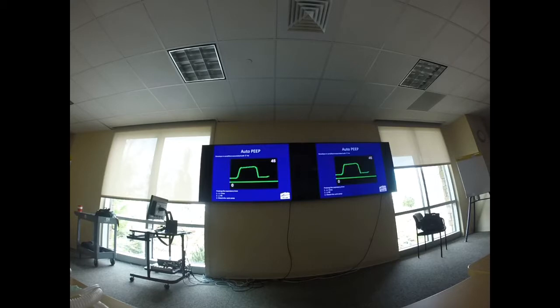And in that patient, I want to do a few things. Really with anybody with auto PEEP, I might want to do a few things. I might want to decrease the PEEP. I might want to match the auto PEEP. But I definitely want to prolong the expiratory time. We talked about ways to prolong the expiratory time in the last lecture, but decreasing the I time and decreasing the respiratory rate will both increase expiratory time. Those are things that I might want to do in a patient who I see auto PEEPing.